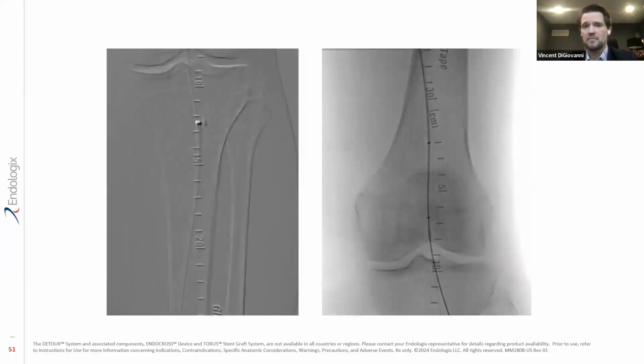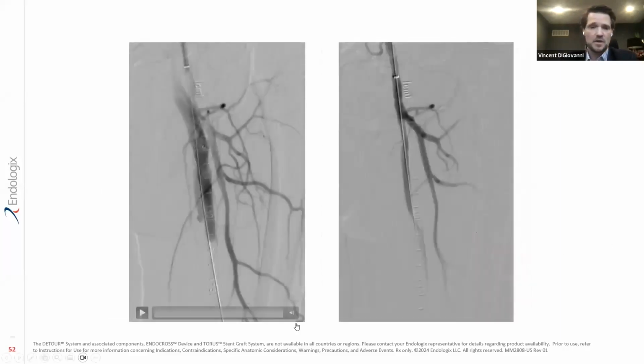Balloon that. So once you get your 035 wire down in, after you get your tandem catheters down, balloon it again. Use your Mustang balloon and really get very, very aggressive with that distal anastomosis. It makes your life so much easier.